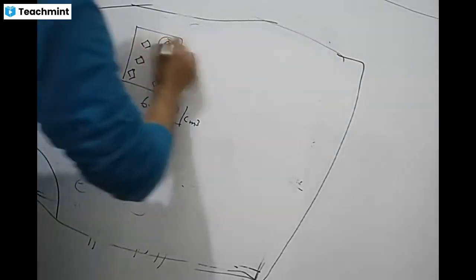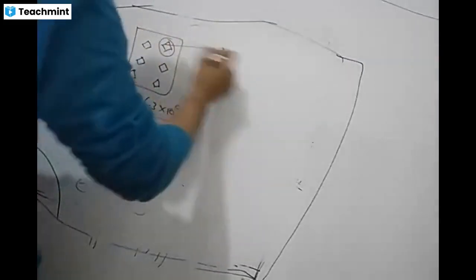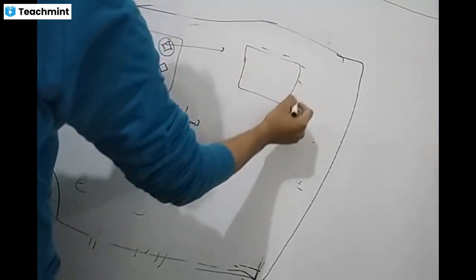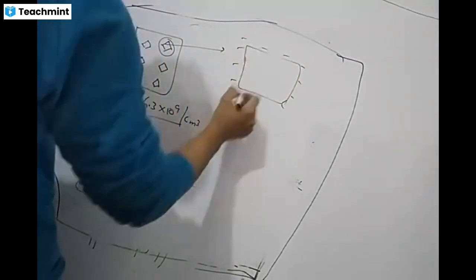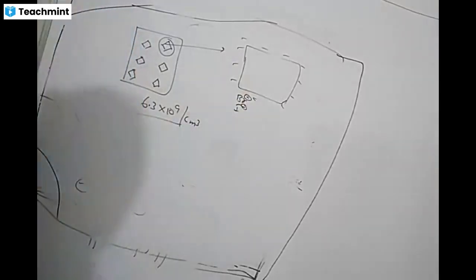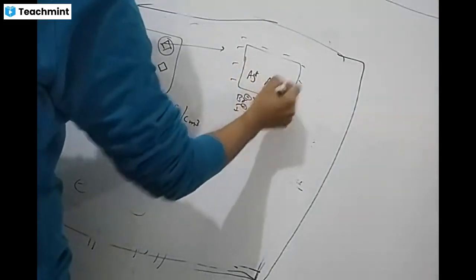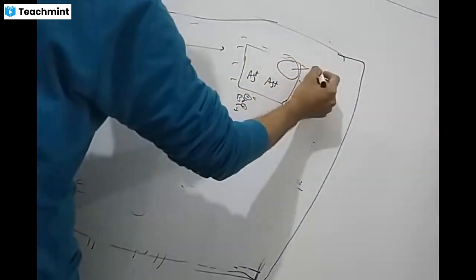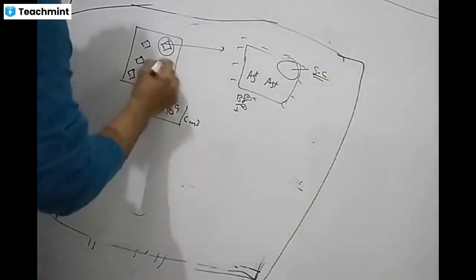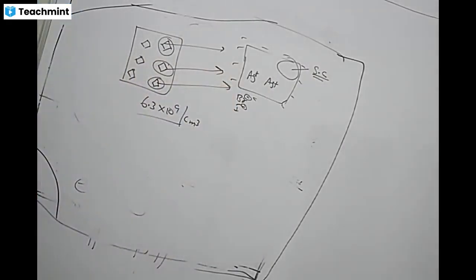If we bring one crystal out, it has negative charges on the surface because of halide ions, mainly bromine and 1 to 10% iodine. Inside it has Ag plus, and it has this sensitivity center. Every crystal has the same structure.